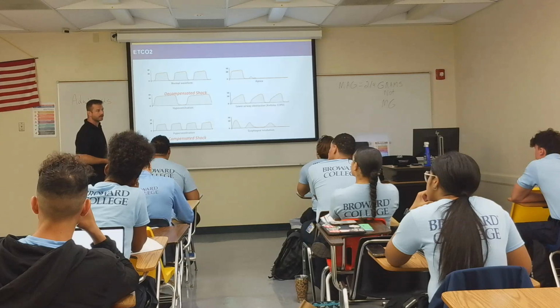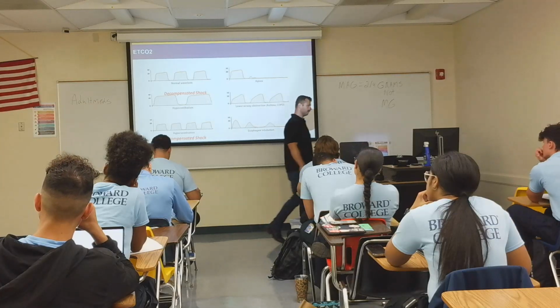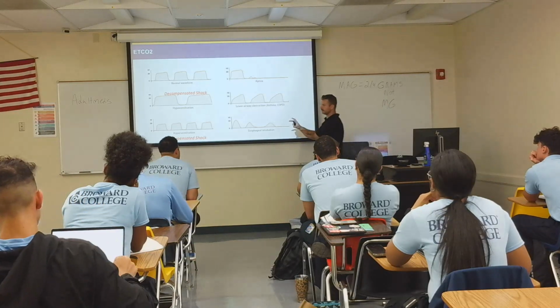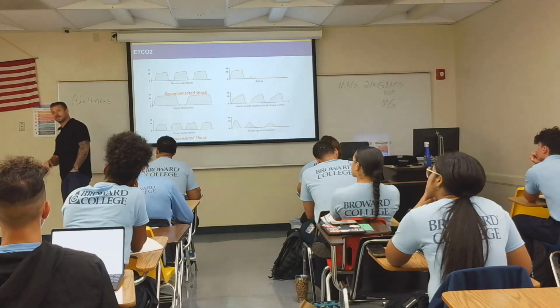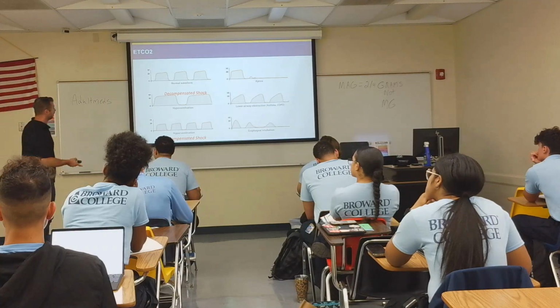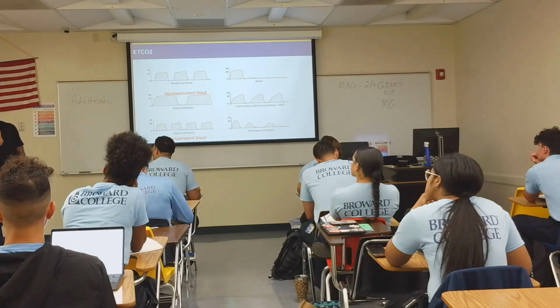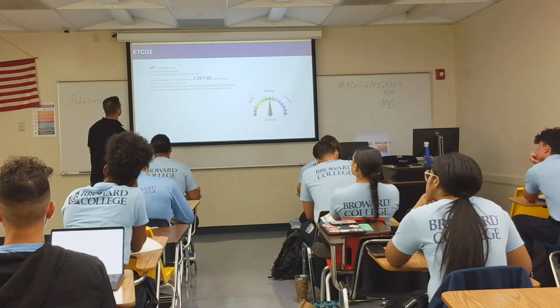Okay, but it's just like if I were to go into a building for a CO check, to see if there's carbon monoxide in the building. When I turn on my gas meter, I have to be outside the regular atmosphere, right? So I gotta let that gas meter get 21% oxygen, normal atmospheric numbers. Once I get that all registered, it's calibrated, then I can walk into the room and it's gonna tell me, do I have any high numbers, CO, hydrogen cyanide, things like that. So it's the same with our end-tidal. I have to connect it to the life pack, let it run through, calibrate, and then I can connect it to the patient. Once it's connected to the patient, I'm gonna be able to get my appropriate number, alright?